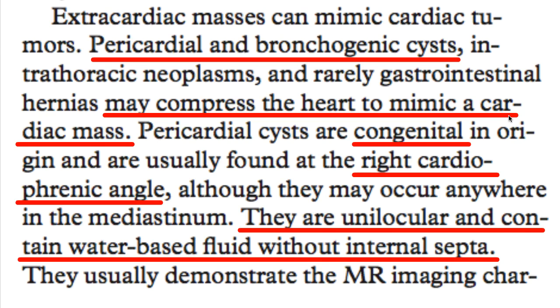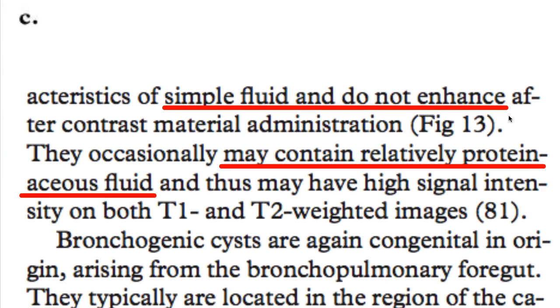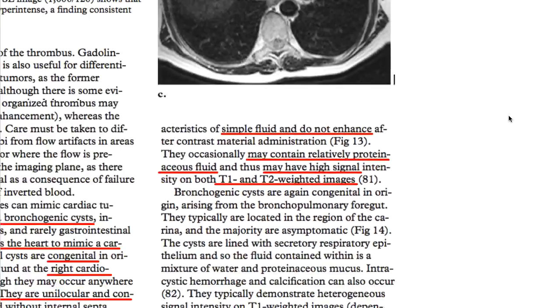Typically, they're unilocular, contain water-based fluid without internal septum. The fluid is typically simple. These do not enhance, but they can contain some proteinaceous fluid, which can affect the signal. Also, one of the things that's important, and we'll see from the images, is that pulsation can affect the signal characteristics, so it's important to look for that. Because they can have mixed contents, that can affect the T2 and the T1 weighting.